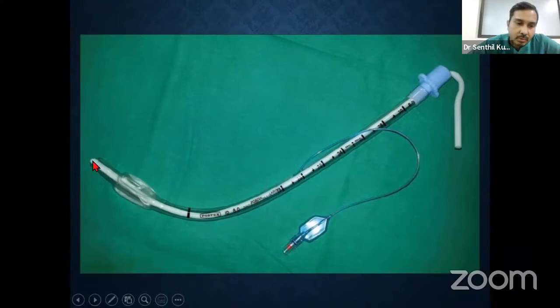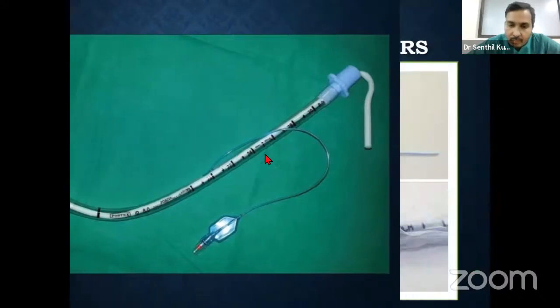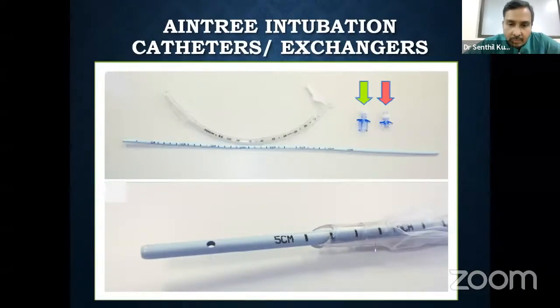You are supposed to introduce the stylet. The tip of the stylet should be at the level of the bevel, and it should be like a hockey stick shape. The last thing I am going to tell is one of the very valuable devices, airway exchange catheters. So these are very important devices; compared to even the bougie, sometimes we can use them for replacement. But the peculiarity of the device is it is of wider diameter and it is a hollow tube. You can see multiple openings.